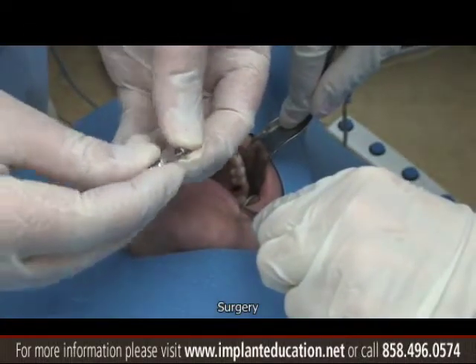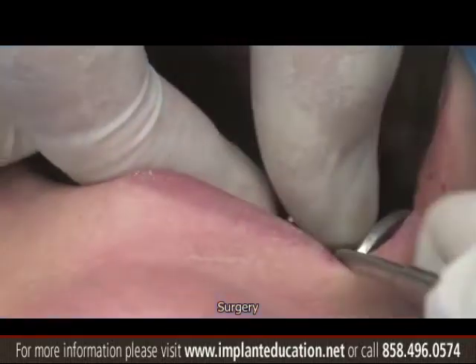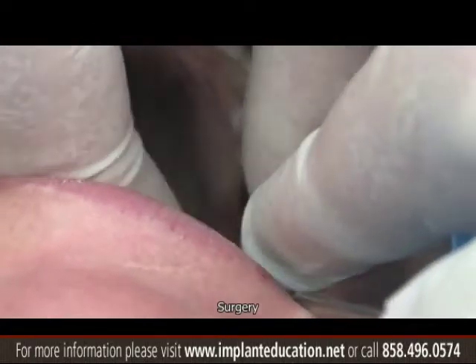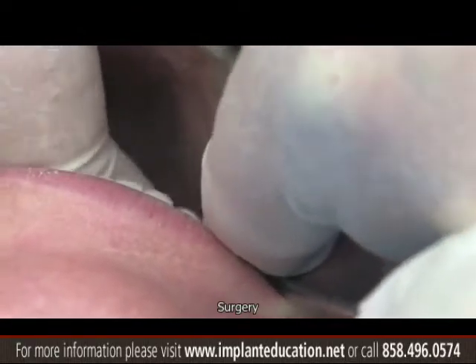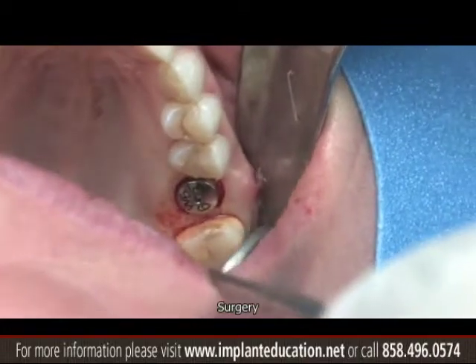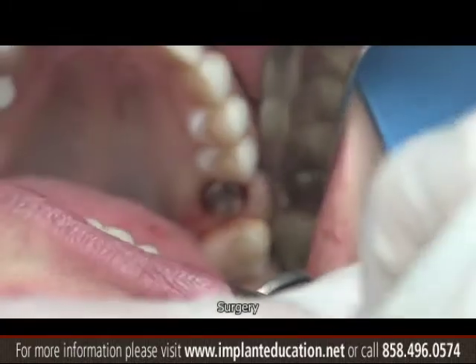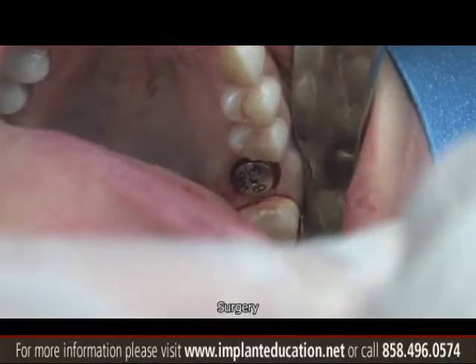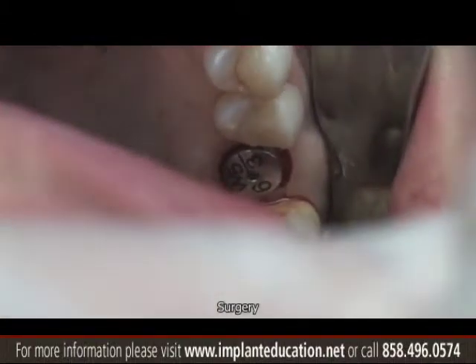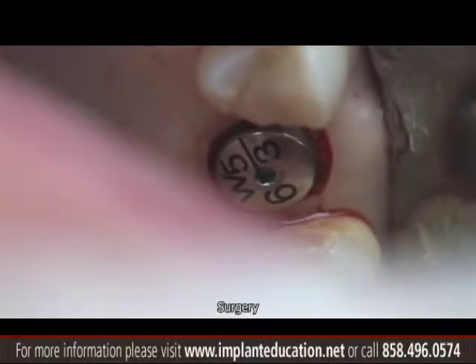For the longevity of the implant, you need a good soft tissue seal above it — anywhere between 2 to 3 millimeters. Initial stability was very close to 35 Newton-centimeters. The implant is not a candidate for immediate loading; however, it is a candidate for one-stage placement. So this is the 3mm height, wide-body cuff healing abutment placed on the implant, and the procedure is done.